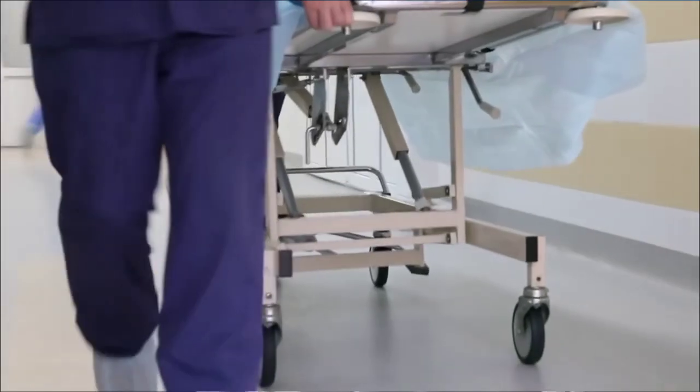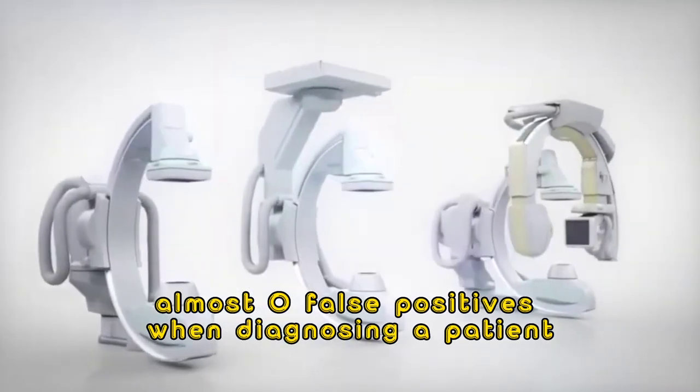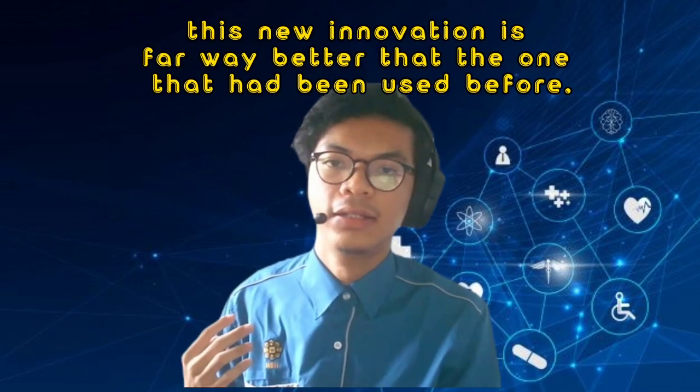With our newest and latest technology, we hope that it can help more and more hospitals use it to the best of its ability to make accurate diagnoses without any error in performing the procedure, to save lives. We believe that our product can still improve to ensure the best diagnosis for everyone. Although older equipment can still be used, our new technology is promising near-zero false positives when diagnosing a patient. We hope that with our new improved equipment, we can help doctors so that their workflow becomes a lot more efficient and more lives can be saved, as we are confident this new innovation is far better than what has been used before.